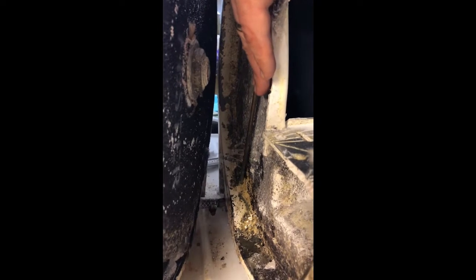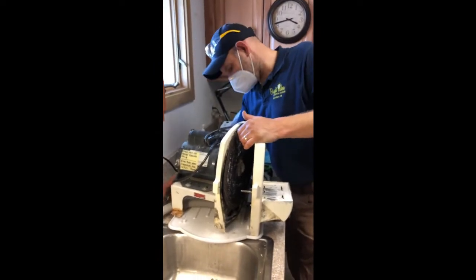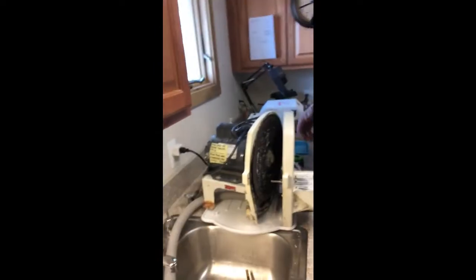Not much. All right, so we'll need to go ahead and repair this. So I'll do that, and then we'll be back.